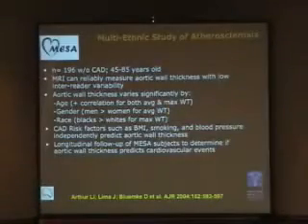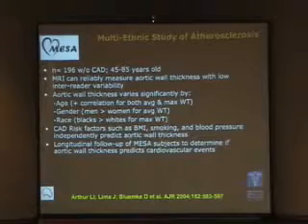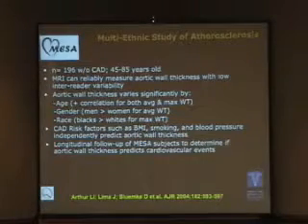So there's a limitation in this kind of measurement if we look at it from that point of view. Now I just want to mention a couple of other examples of what has been done with magnetic resonance imaging. I know of several trials, and one of them is the Multi-Ethnic Study of Atherosclerosis, an NHLBI-funded, multi-center study. One of the things they are doing is looking at aortic measurement of atherosclerosis.